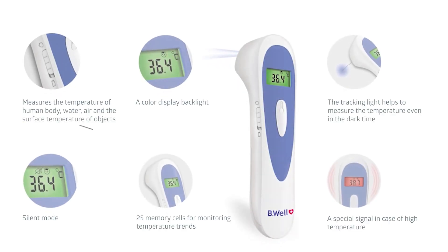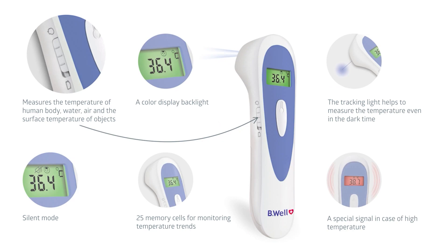Be Well Med 3000 is a versatile thermometer that can measure the temperature of the human body, water, air, and the surface temperature of objects.